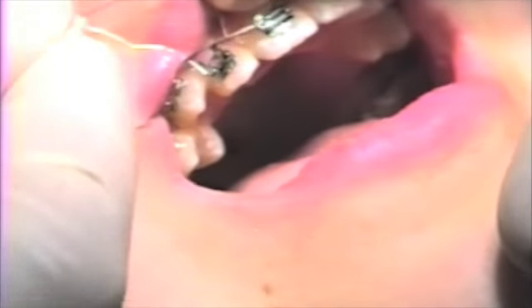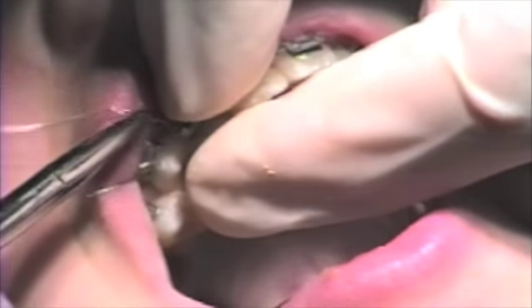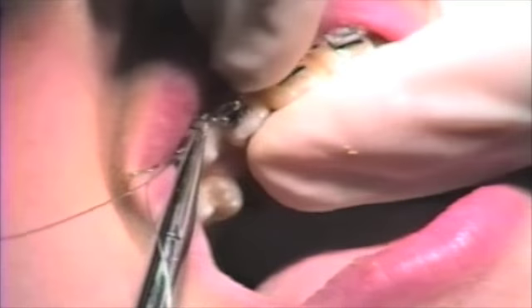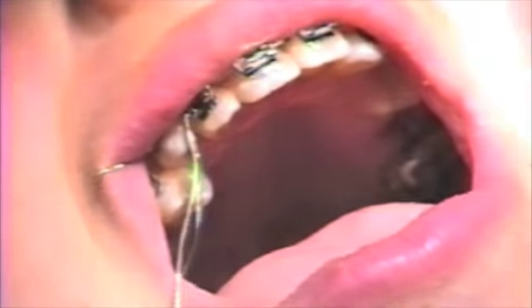Now we will do a double over tie on the upper lateral incisor. Remember to hold the arch wire towards the arch wire slot as you tighten. In this case, bring the arch wire from the gingival of the tooth towards the slot.